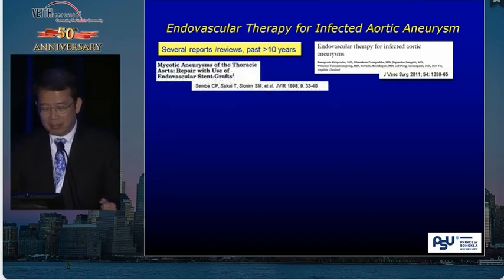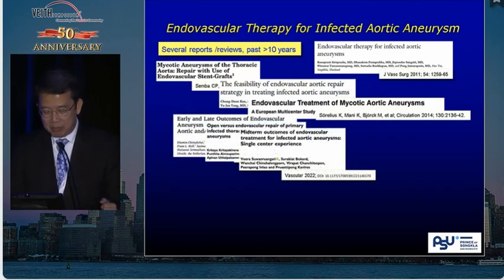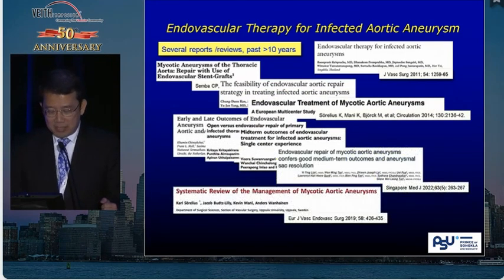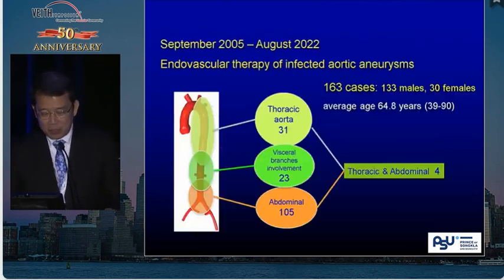Before and after that, there were numerous reports of the treatment of infected aortic aneurysm, including a few systematic reviews. Most of the reports indicate good short-term and mid-term results. However, there are concerns about the long-term outcome and the incidence and type of late complications.